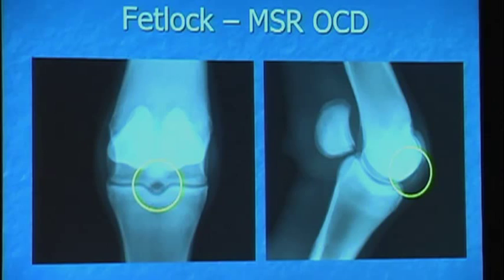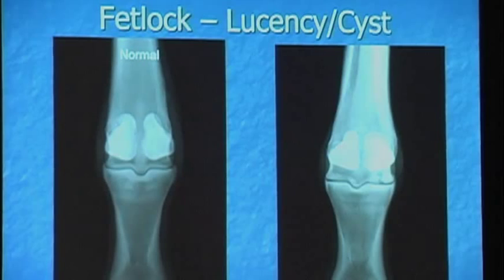Next we have fetlock lucencies or cysts. Here you see the distal cannon bone, sesamoids, P1, and these are the condyles that we always talk about with a medial condyle lucency. Here is one where we have this subchondral — which means within the bone, deep below the articular surface — subchondral bone cyst. Some cysts, depending on location and size, might be okay. Maybe they're in the front of the joint versus the back where most of the weight is borne, but this one's really on the meat of the condyle or the heavy weight-bearing surface. This would be a concern at sales, and rightfully so.